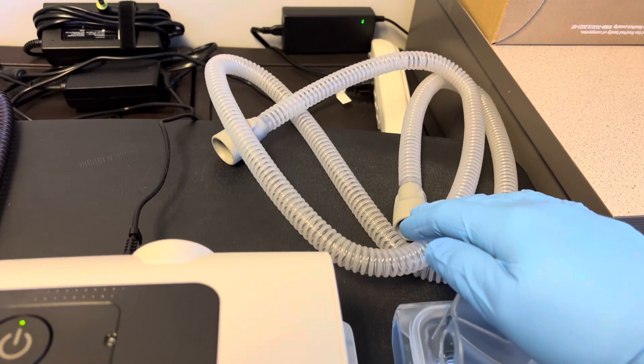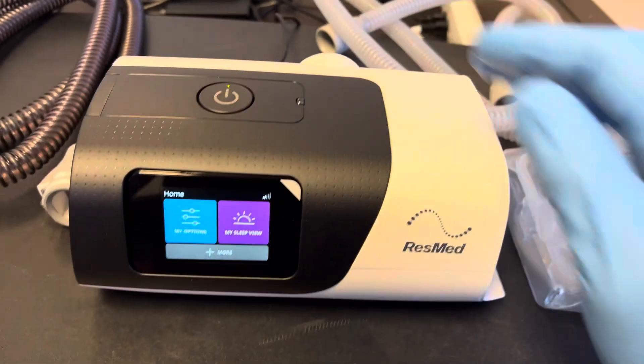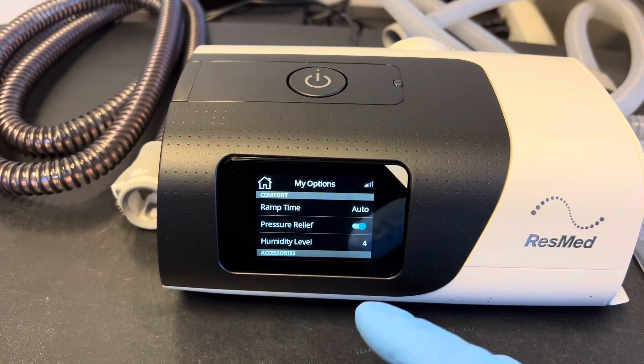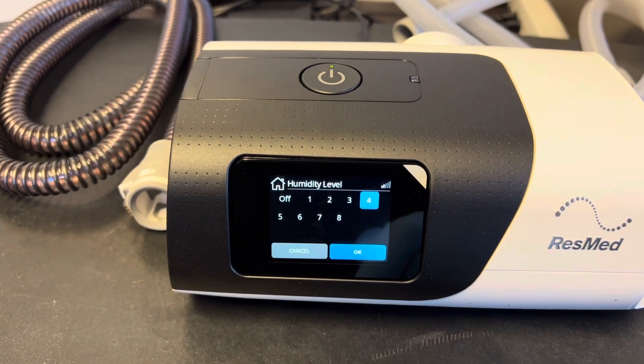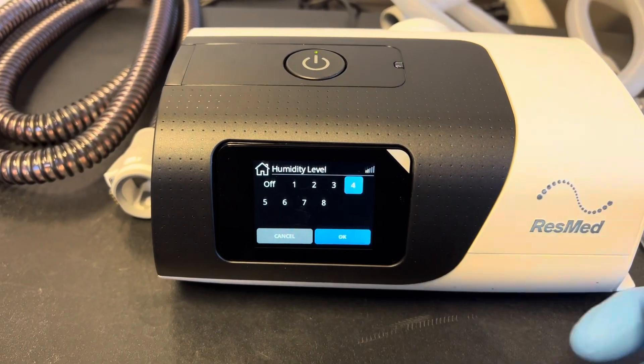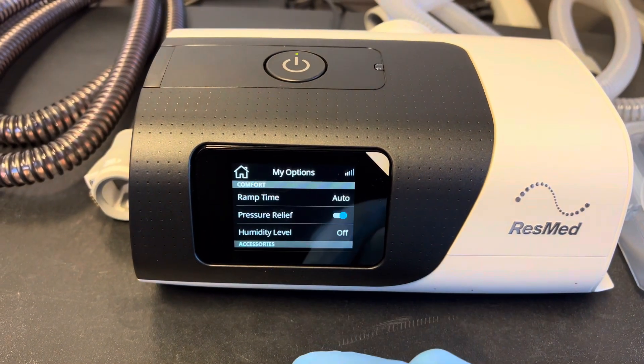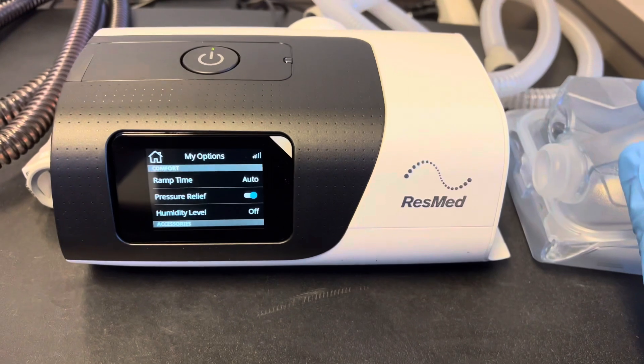If you're just using a standard hose with two rubber ends that pushes into the back of the machine, all you have to do is come to options and click on humidity level. All these settings are going to run heat off that heat plate, so you want to turn that off and press OK, and that will prevent this from overheating.